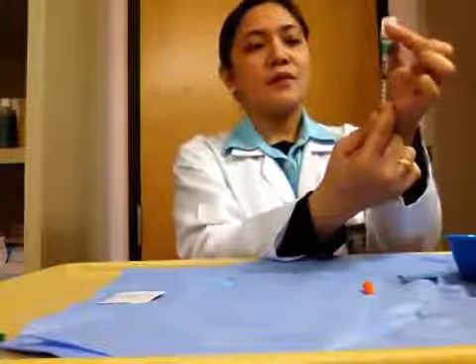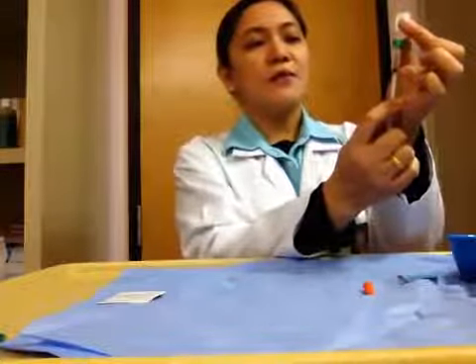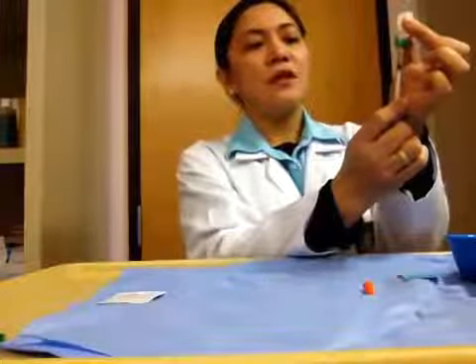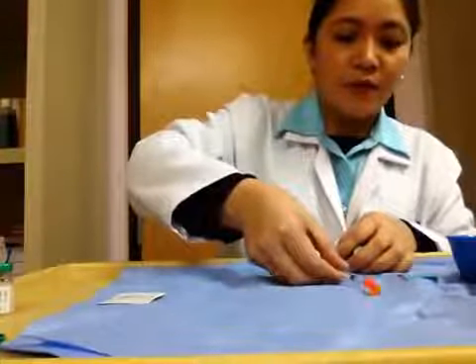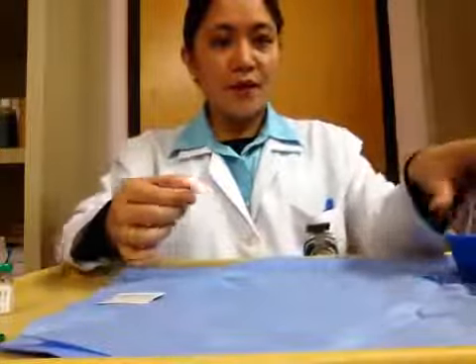This is somewhat viscous, so it takes a little time for us to aspirate the medication, plus the fact that the needle is very fine, gauge 29, so it takes a little time to get the medication. Okay, so it's now 20 units. We'll see now it's at the 20 unit calibration, and then recap your needle using the scoop method. Okay, fix it well, and now we are ready to go to our patient's room.